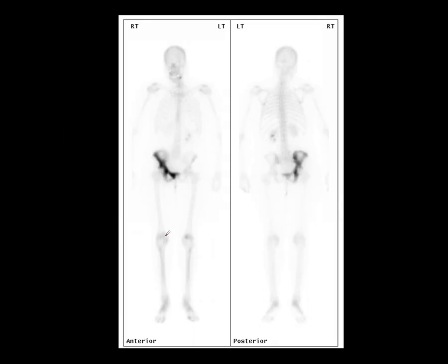So, speaking of Paget's disease — this is a patient with that condition. It's very important to recognise because it's common and shows very significant radiotracer uptake, which can cause confusion with metastases, especially in patients with underlying malignancy. As a tip, Paget's disease is very rare under the age of 40. It will always begin at an epiphysis or an apophysis, and quite commonly takes over the whole of a bone, working its way around it.